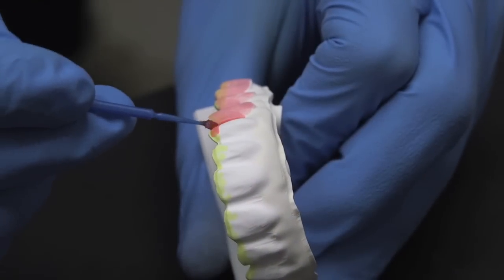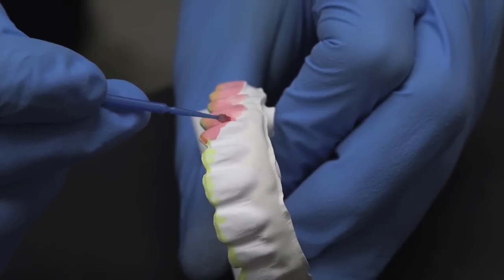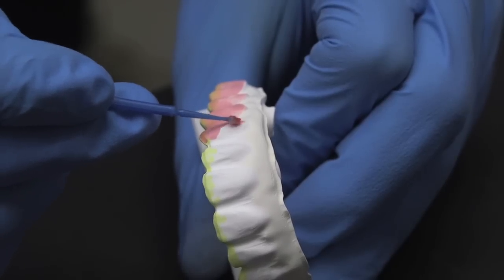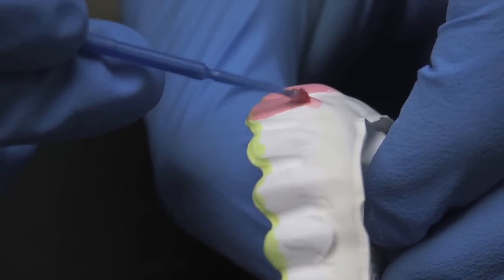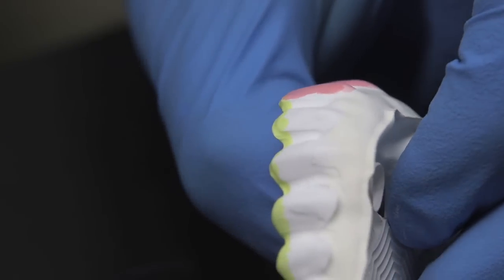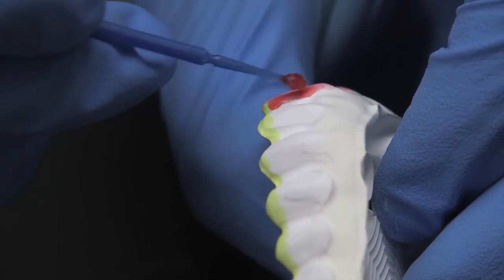Next, it is time to apply the Denton shading liquid to complete the shading process. During application, take care not to paint the tissue portion of the bridge. Once all areas of the bridge have been treated, the bridge is ready for sintering.